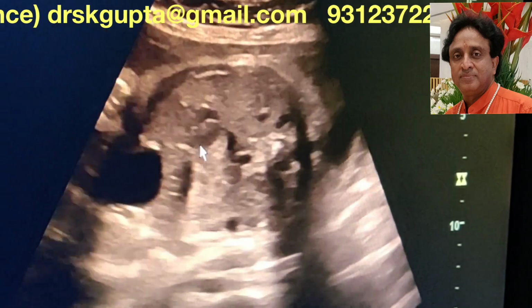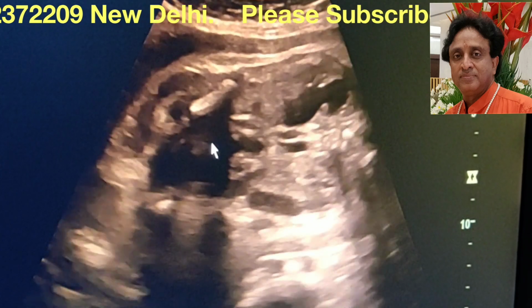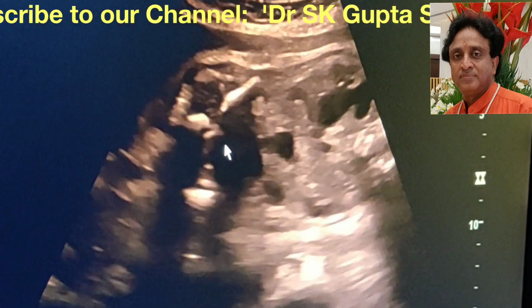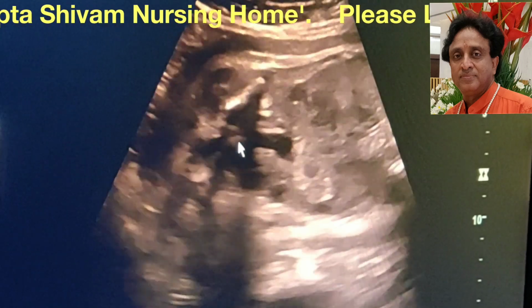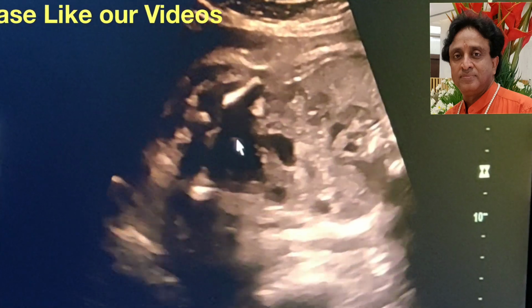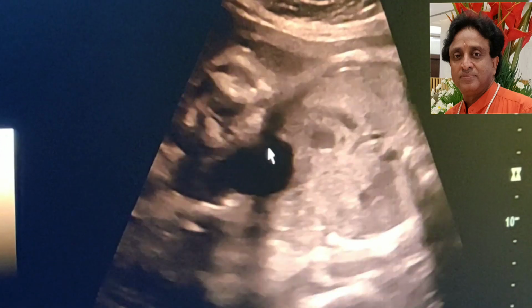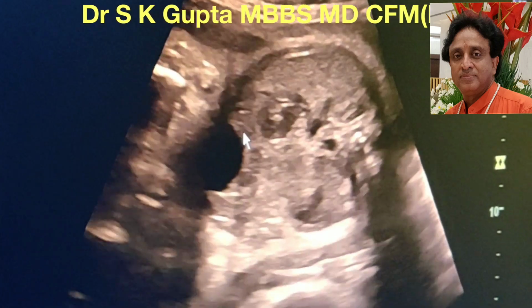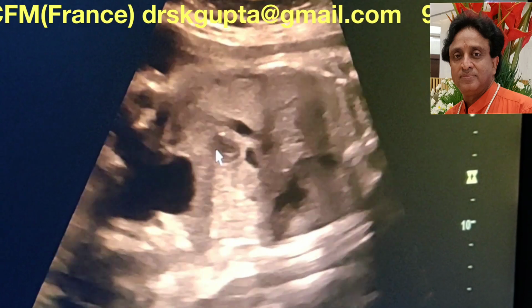So the liquor is normal and the bladder is well seen. If you want to see whether the bladder empties within 20-30 minutes or not, it should normally empty in 30 minutes if there is no proximal urethral obstruction. But as the baby has advanced to this gestation, it is quite unlikely that there is proximal urethral obstruction. The most likely cause is vesicoureteric reflux or PUJ obstruction.